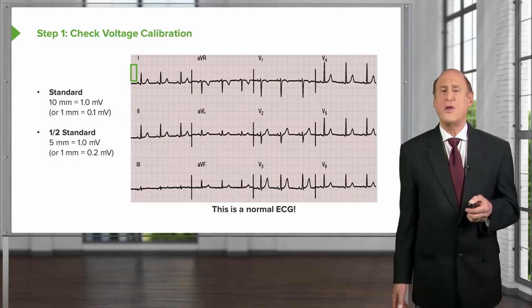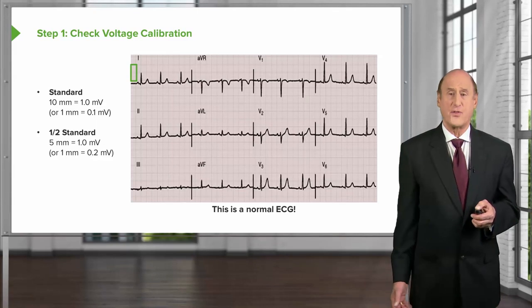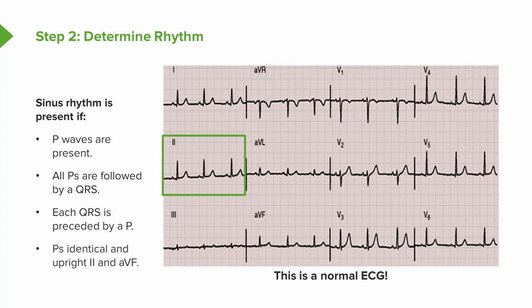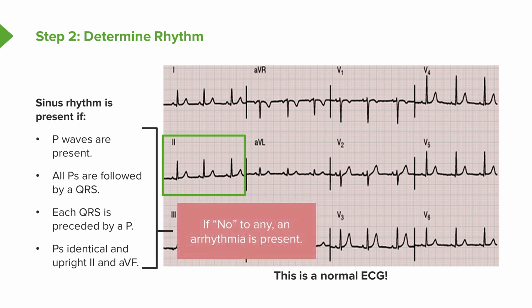You'll notice sinus rhythm — each QRS is preceded by a P wave, meaning the atrium depolarizes before the ventricle. All P waves are followed by a QRS with no blockage of the beat going through the heart. Each QRS is preceded by a P, and the P waves are all identical — upright in leads II and AVF and nice and narrow, not prolonged. If the answer to any of these checks were no, then you're talking about an arrhythmia. Right now we're just focusing on the normal.